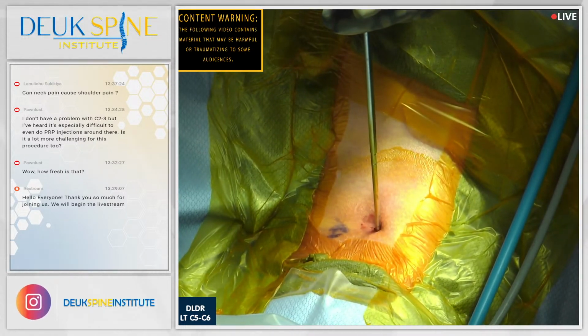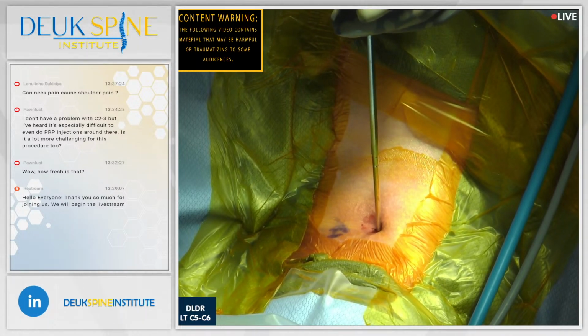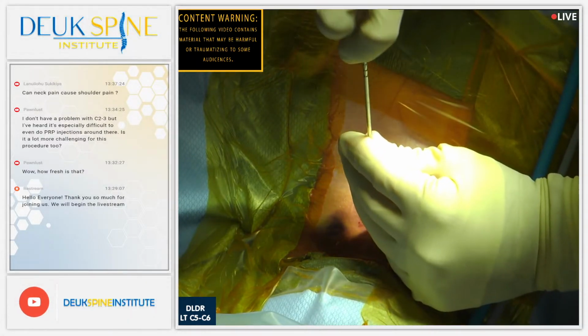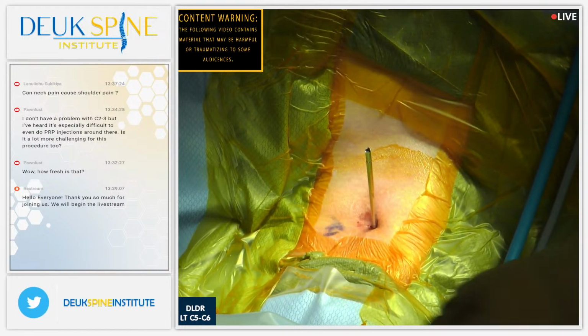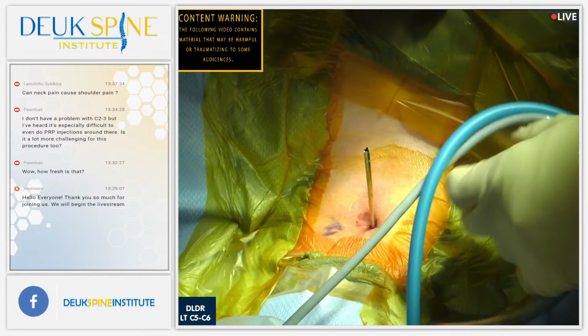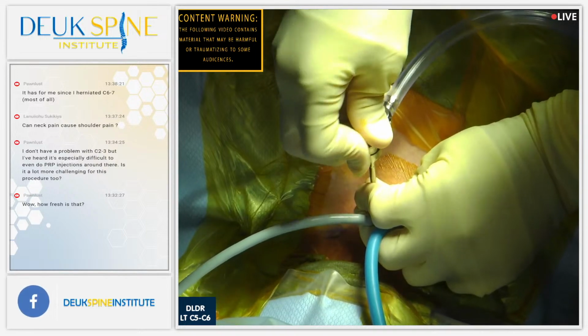Shot? Almost there. Any questions, Shot? Yes, we have a few questions. This next first 2 are coming from Pawn Lust on YouTube. All right, we're at the back of the disc with the tube. Jordan, show us the tube is at the back of the disc. So now I've got a channel that I can see the herniation and remove it with a laser. All right, I'll take the questions.